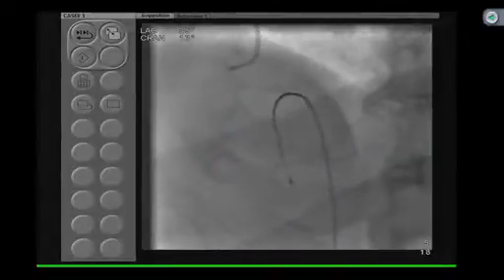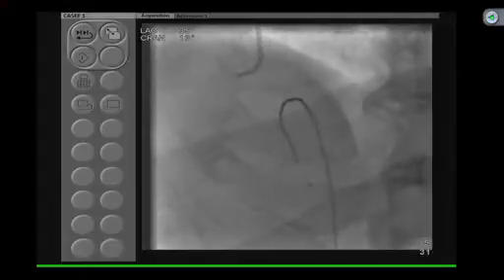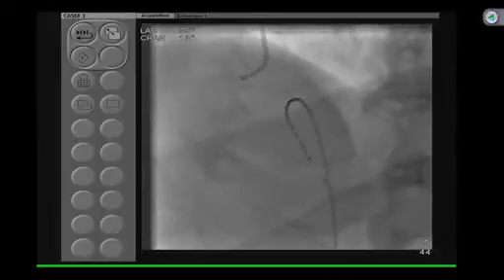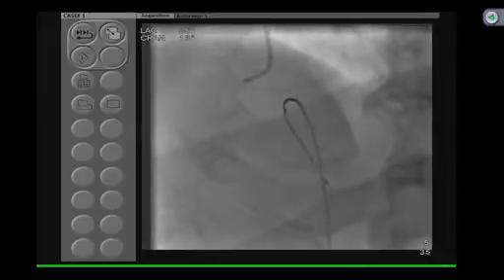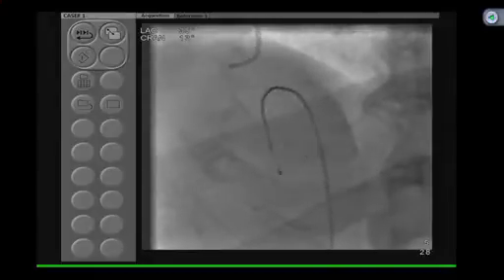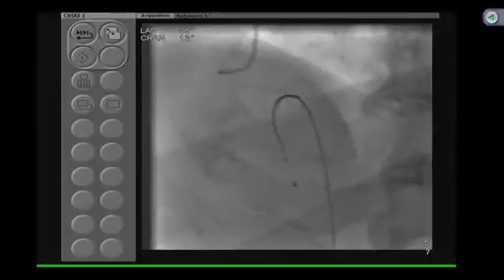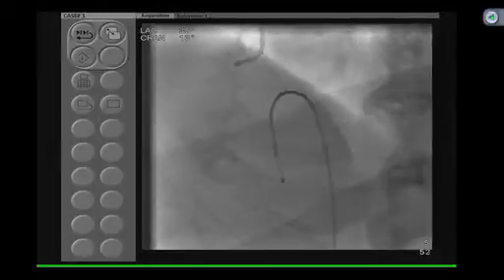If you can see there exactly around 7 o'clock, see the chunk of calcium actually like 8:30 area, and the lesion is little proximal to it. See that, I felt that will be angiographically clearly we decide based on the angiogram whether to decide rotablation or not, and based on the angiogram we decided. Now question comes, knowing that the lesion itself is not calcified, but the process around the lesion proximal and distal is still very calcified. So, that should the rotational atherectomy be done.